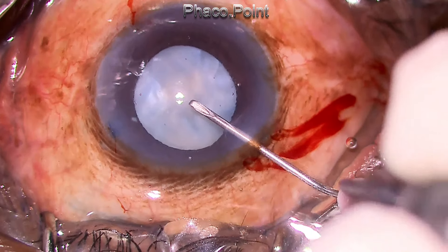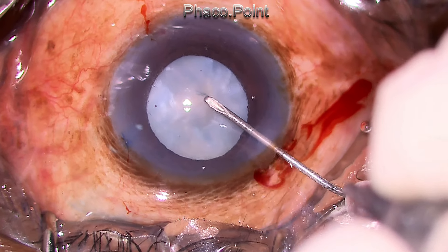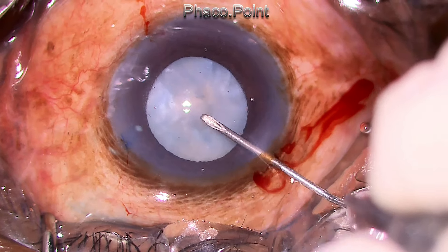The anterior capsule was very tough, so an initial puncture was made with the help of a 26-gauge cystotome, and then the Utrata forceps were used to complete the capsulorhexis. The milky cortex that issued out was settled down with the help of methylcellulose. You don't have to use a dispersive or cohesive viscoelastic because there's no positive intralenticular pressure in hypermature cataracts.